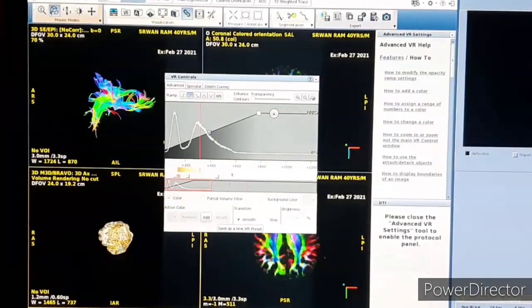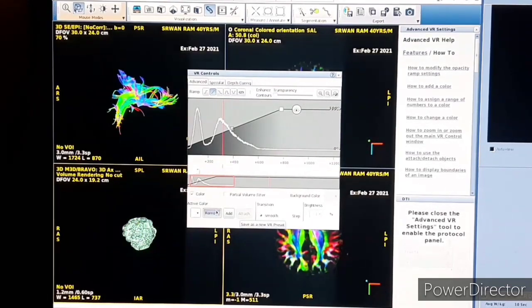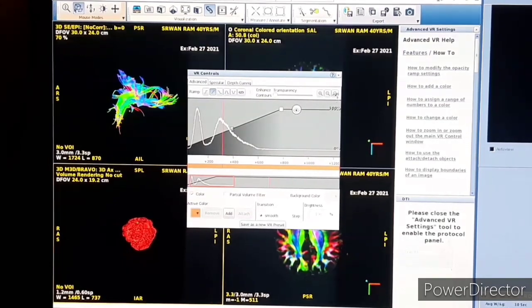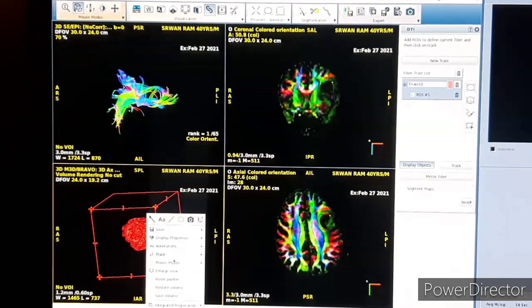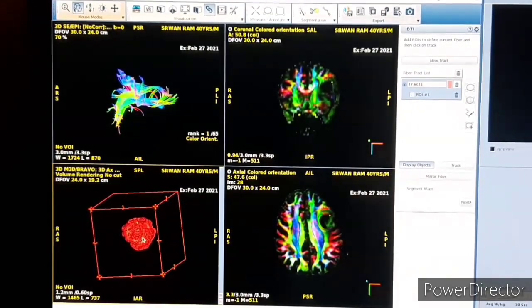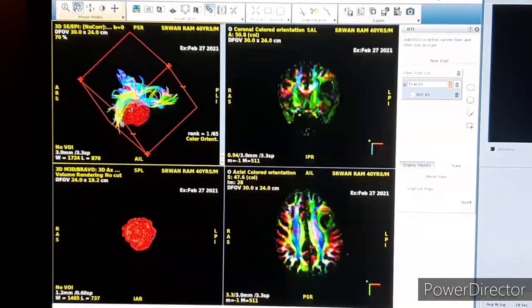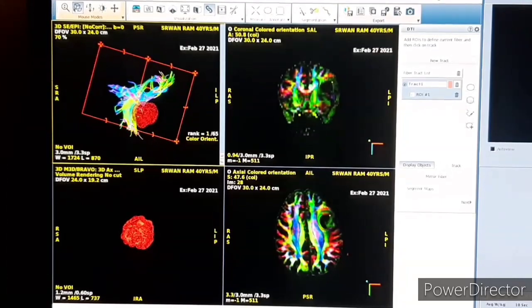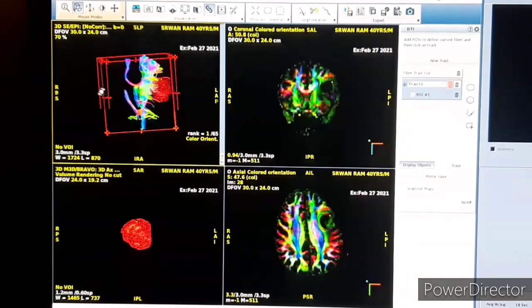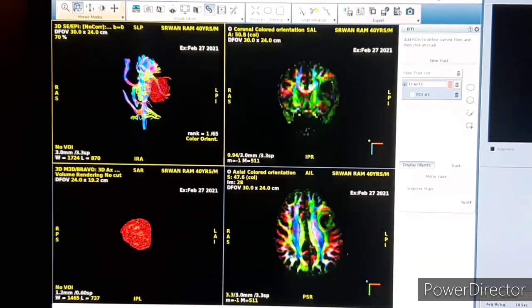Now how to trace on the nerve fibers — we go to settings for the color. We can give many colors to the tumor; I am giving red color. Then we go to Mouse and Select, we just track and drag on the nerve fibers, and you can see the nerve fibers and the tumor in 3D.